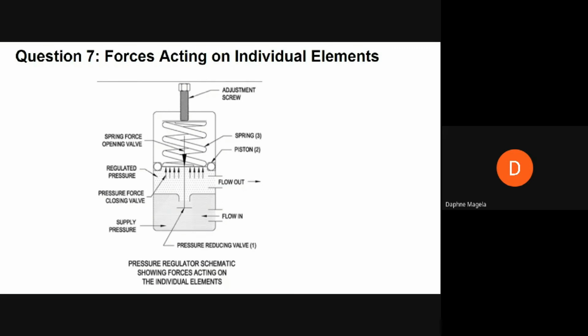There are many factors that cause failure in pressure regulators, and these are damage to internal components, droop, and changes in inlet pressure. So over time, the moving parts of the regulator, such as the diaphragm, experience a significant amount of force, and they eventually succumb to degradation, making them less responsive than they should be. In other words, the older a regulator gets, the more prone it is to failure because the internal components get damaged, leading to a change in the outlet pressure.